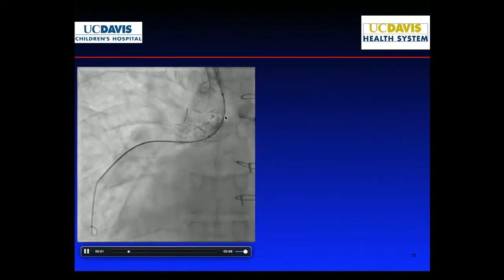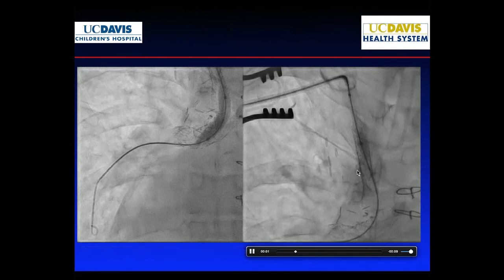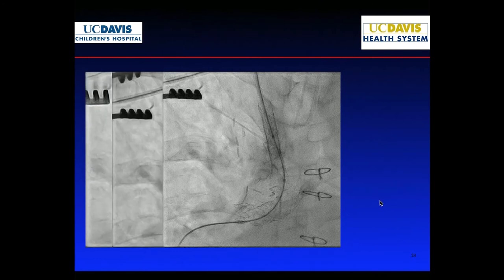So eventually we opened up this side cell. You can see there's a waist there. Probably went through the side of the first row of cells, and then just ballooned it some more to give us a little more pathways. Notice that there's a little waist from that little edge that we had created when we first attempted to put in the sheath. And we just keep going here.